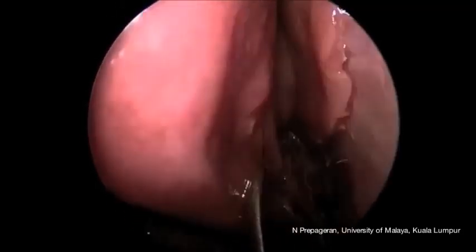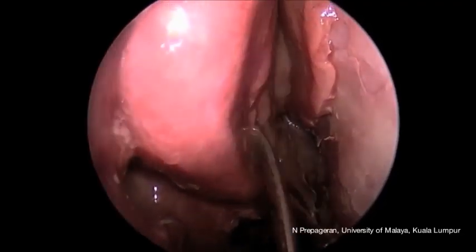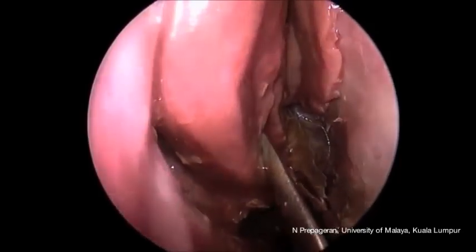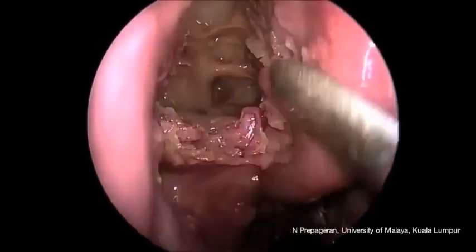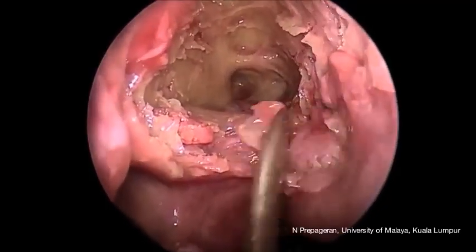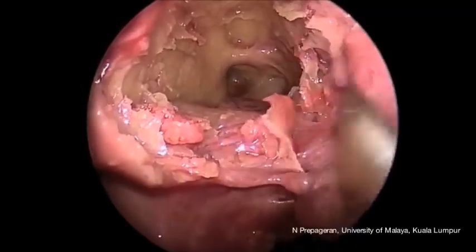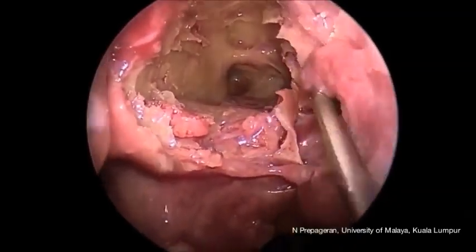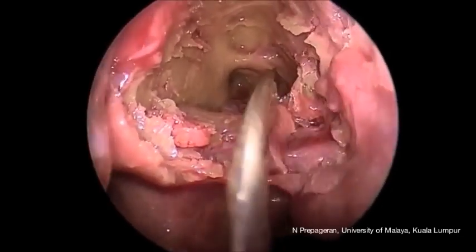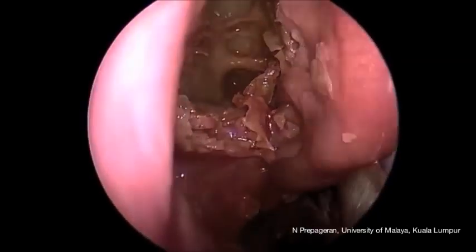We know that the posterior ethmoid has got the superior turbinate as its medial boundary, and we are able to see the superior turbinate here very nicely. And then if we go back again into the middle meatus, we can identify the superior turbinate from the lateral aspect, and then we know that we are already in the posterior ethmoids, and what we are seeing is indeed the posterior ethmoidal artery and the orbital apex and lamina papyracea.